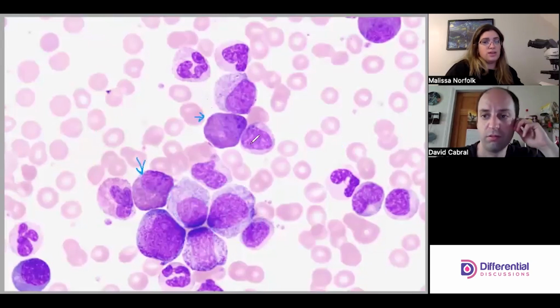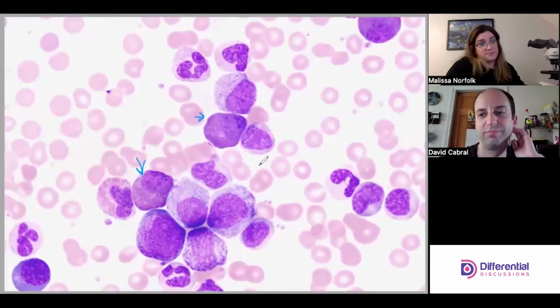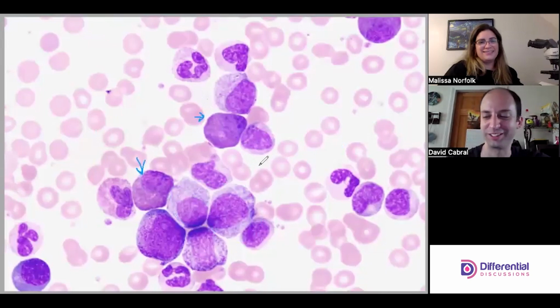They may just lump them under eosinophils and say that there are immature forms present. Or maybe they'll make you actually differentiate. Is it a myelocytic eosinophil, a metamyelocytic eosinophil? If I were king and it was my lab, I'd say enough already. Put a comment: immature forms present. But like this one, you can actually see a Golgi clearing.